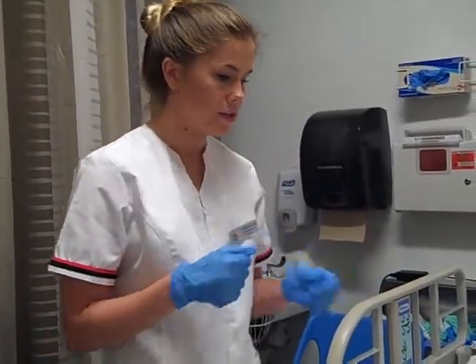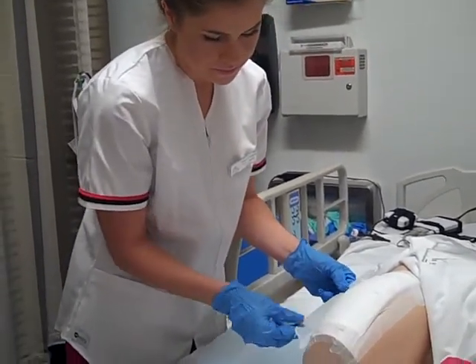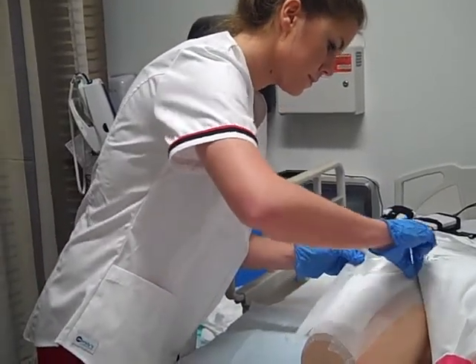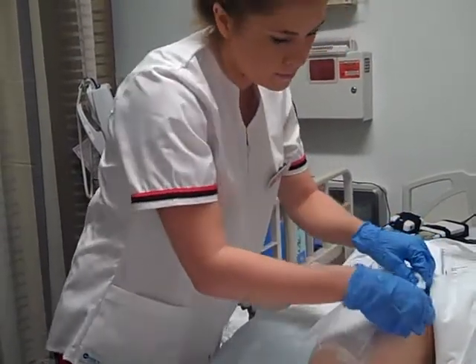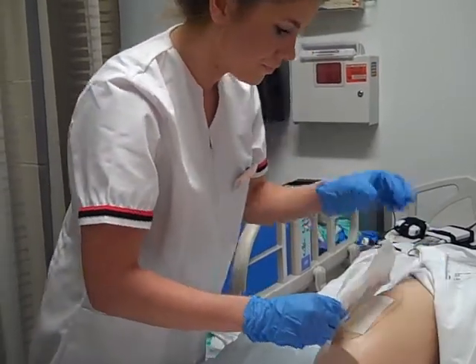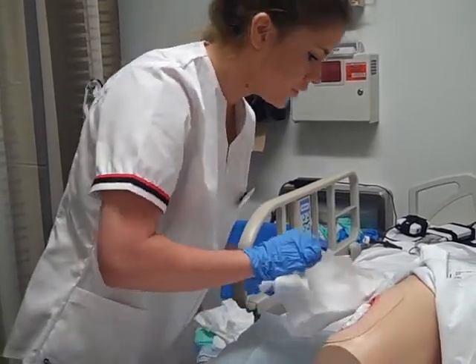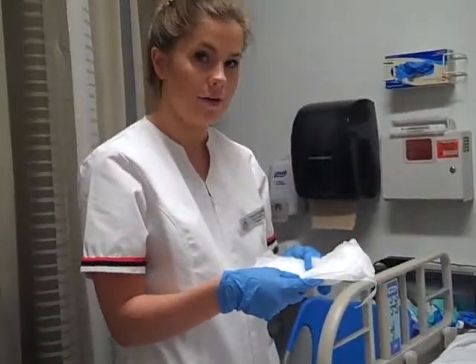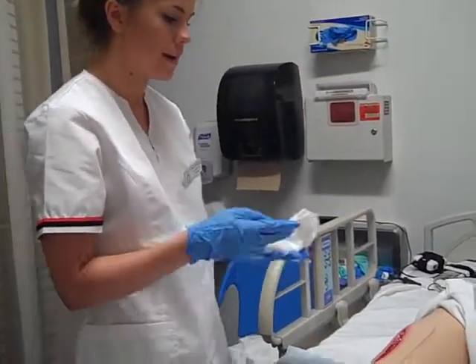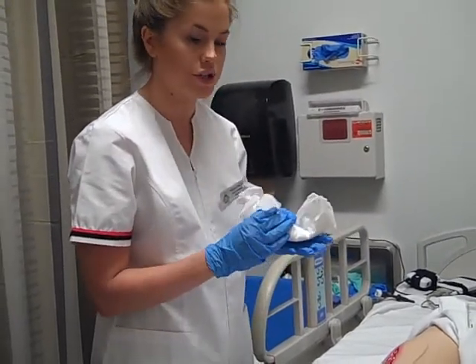Okay, now I will begin to take off my patient's old dressing. When I am taking off the dressing, I will note drainage, color, amount, and if there was any odor. I then would assess the wound. I would assess the wound bed color, the coloring of the skin around the wound edges, the closure of the wound, and if there were any drains present.